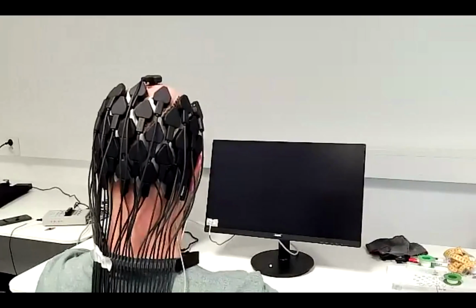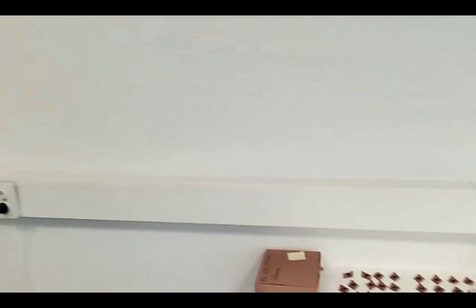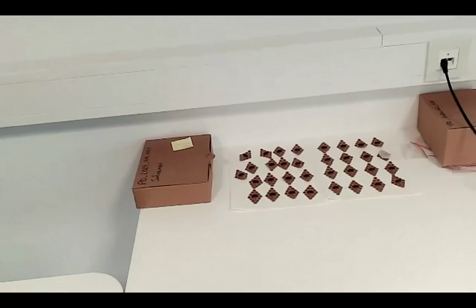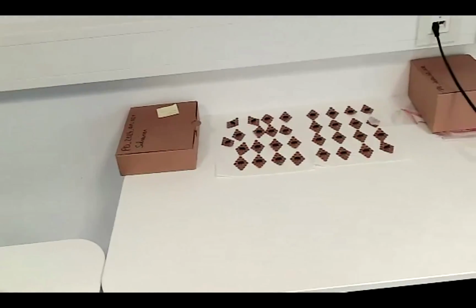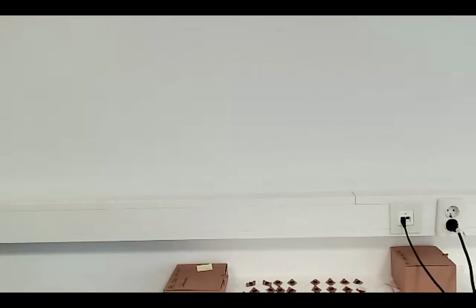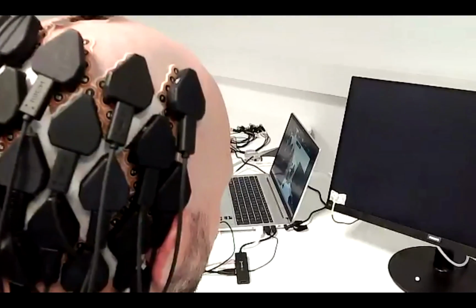We did some experiments. Actually, I also did experiments on myself, similar to the ones we do with Patrick today, and you can see them here. We clean the electrode grids from the adhesive and the gel that we use, and by doing that, they're reusable. These flexible PCBs can be used in new experiments, a couple of times. Of course, you should clean them carefully because they're very slim and thin so that they cover the scalp nicely.